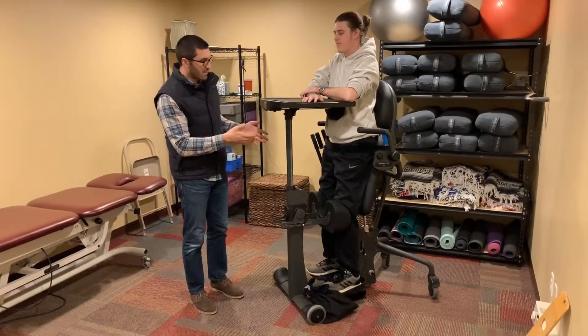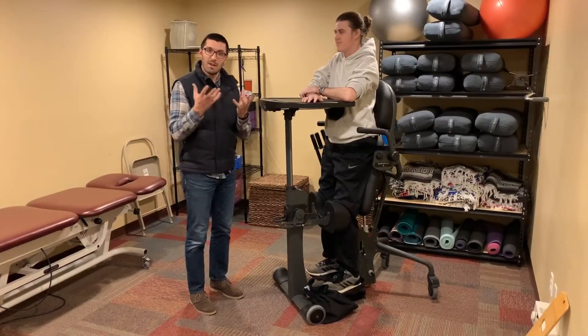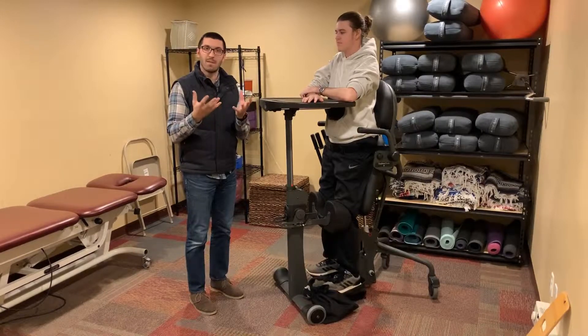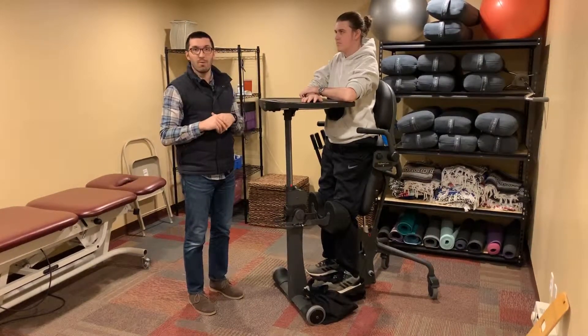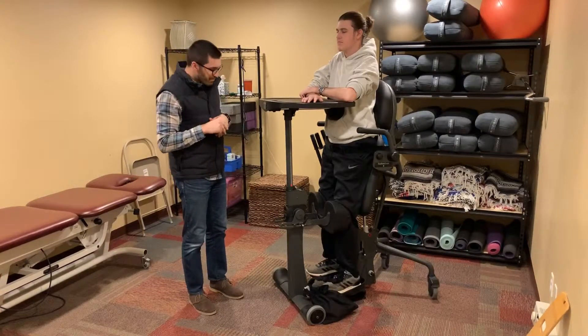One thing that we haven't tried together is using electrical stimulation to add some muscle pumping, which is going to help with blood flow return up to the heart and to the brain as well.